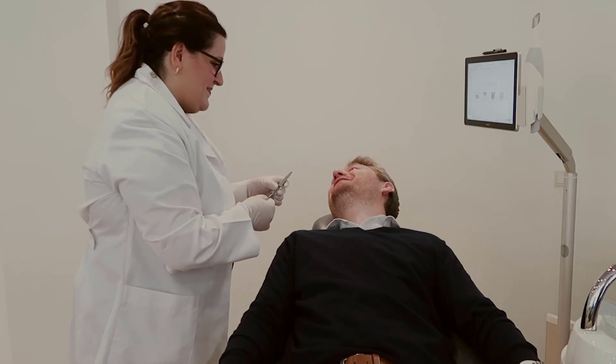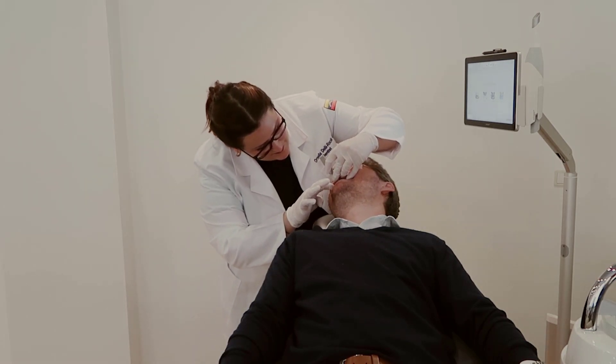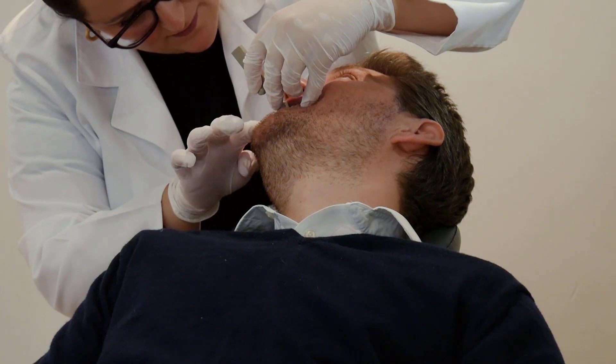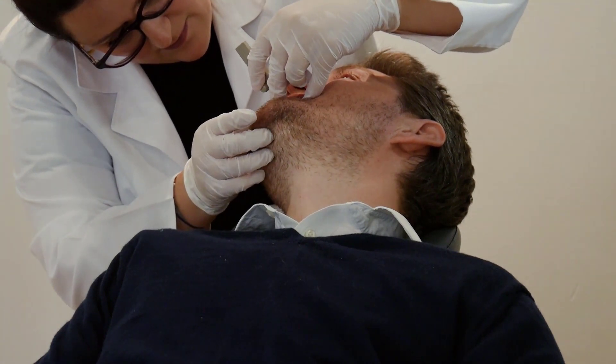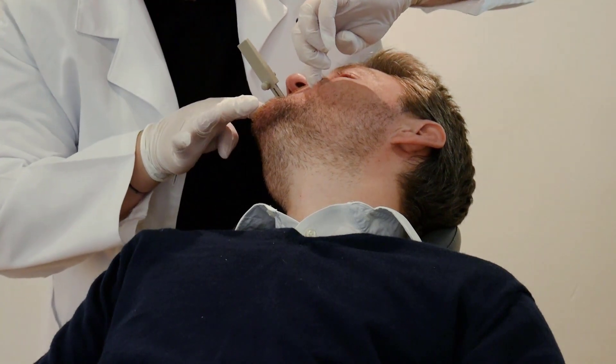When the gauge is in the patient's mouth, the jaws with the gauge need to be stable while scanning. Use the preferred bite method and remember to trim away unnecessary material, especially from the buccal side, so that the material will not cover the teeth.